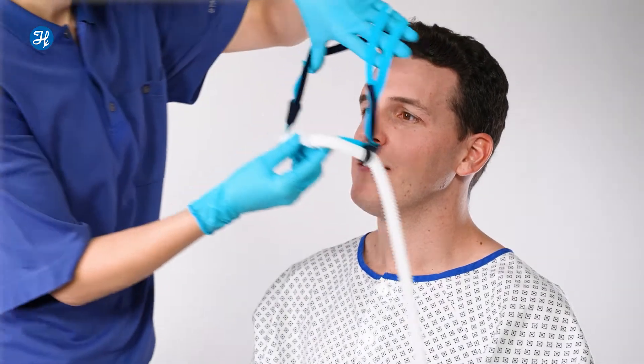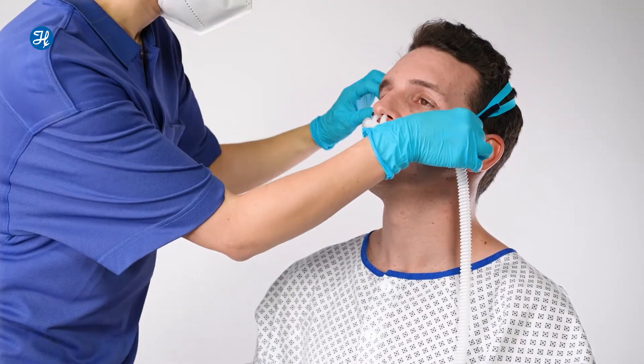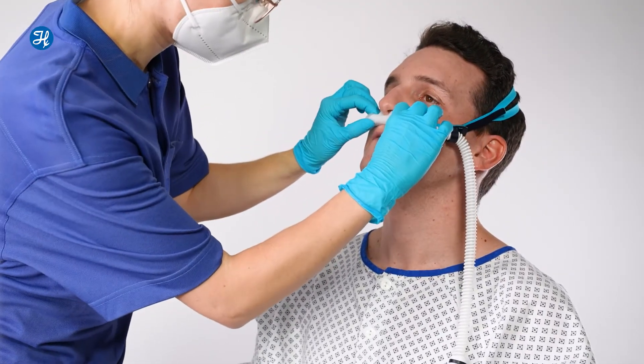Place the twin strap headgear over the patient's head and adjust the position of the soft fit prongs as required. You can also adjust the headgear if needed by shortening or lengthening the strap on the side. Then connect the securing clip to the patient's clothing.